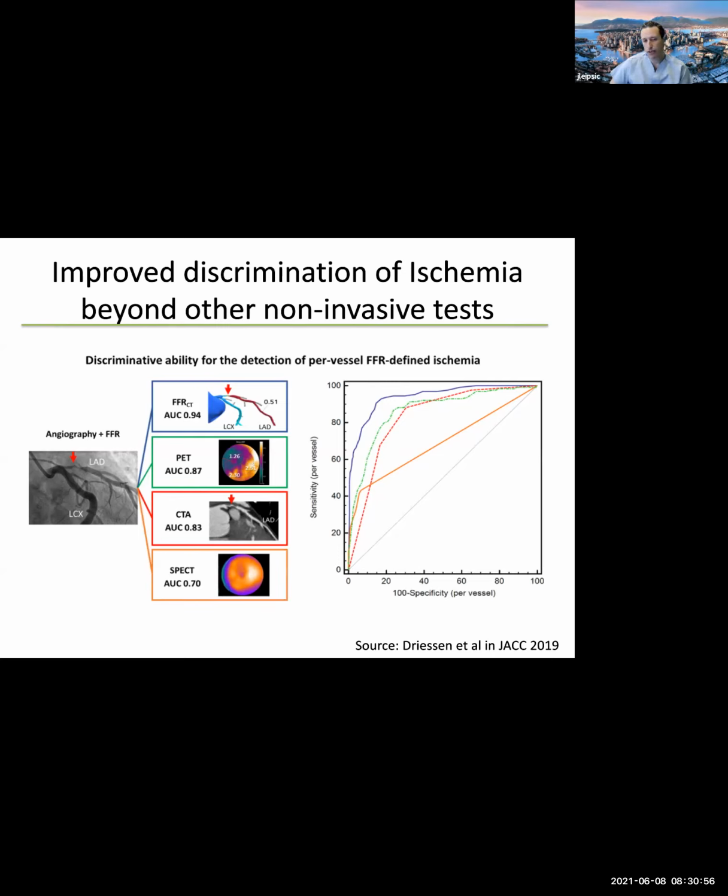But I think the real opportunity as we pivot to clinical utility and guiding PCI is that if you do a CT FFRCT pathway, you don't just provide anatomy and you don't just provide a surrogate measure of physiology by way of PET, but you actually allow yourself to send the patient to the cath lab with a roadmap of the anatomical lesion length, the morphology of the plaque, perhaps fluoroscopic angulation, the translesional pressure, and the physiology.